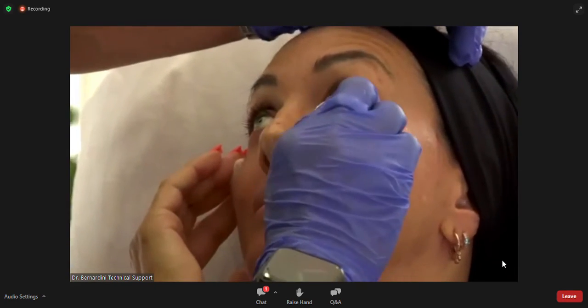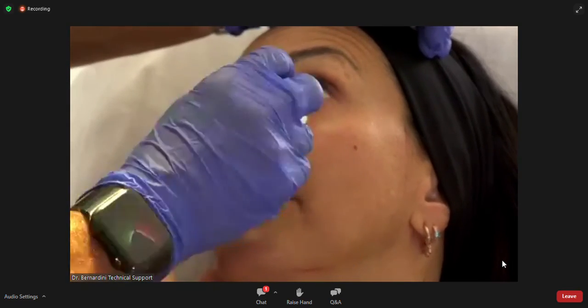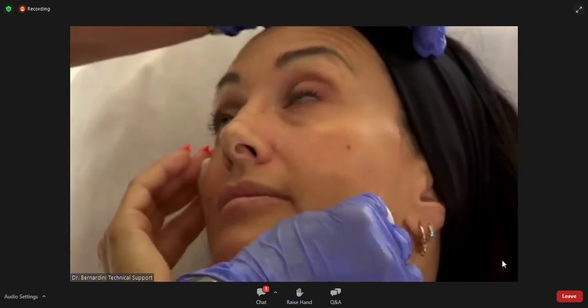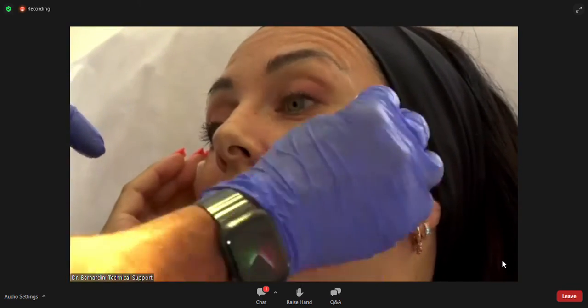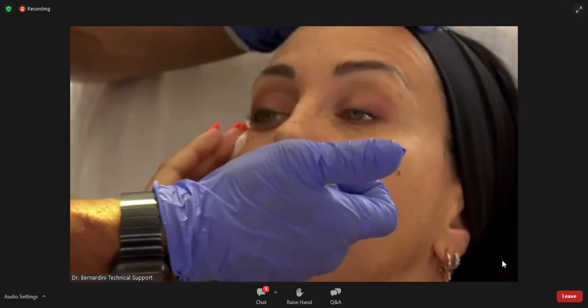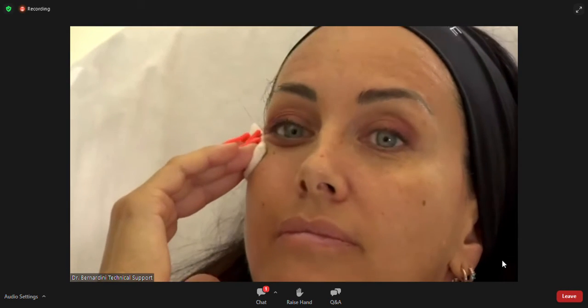Regarding the anatomy, I'm always gliding my cannula when I come from here to here on the superficial planes, well above the infraorbital artery and so on. When I pass the artery, which is about here, and get to here, that is where I change the angulation. Okay. Okay, now.